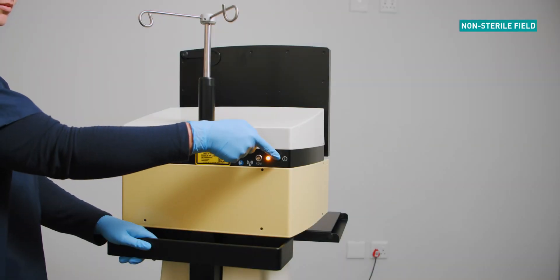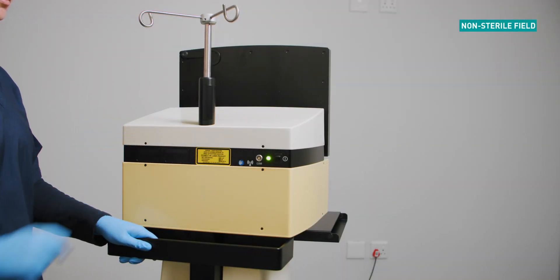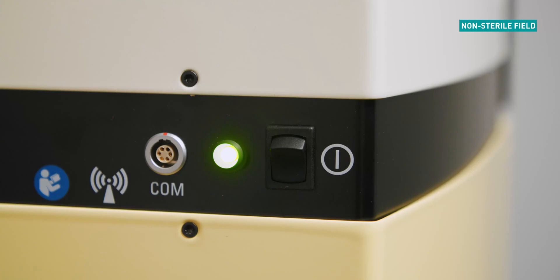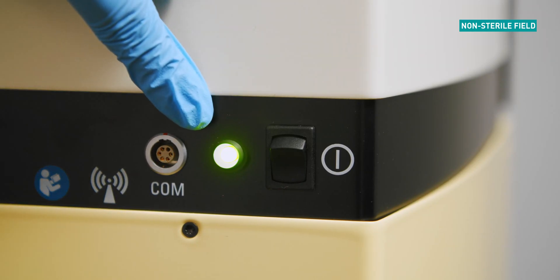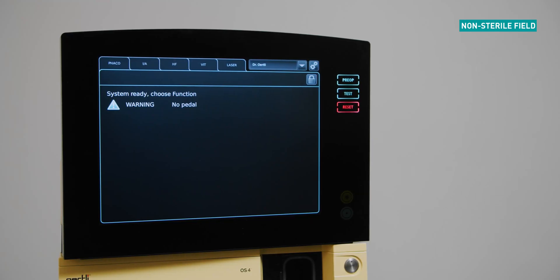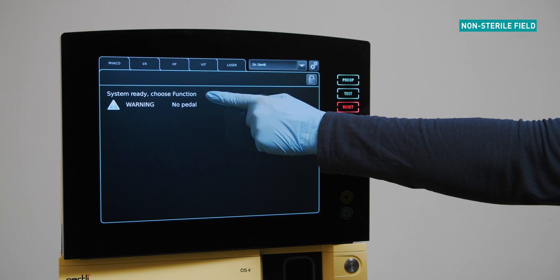Press and hold the on off switch at the back of the machine for two seconds. Ensure the LED indicator is green. If the startup function has been completed successfully, the system ready message will be displayed.